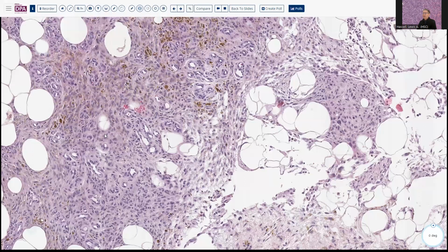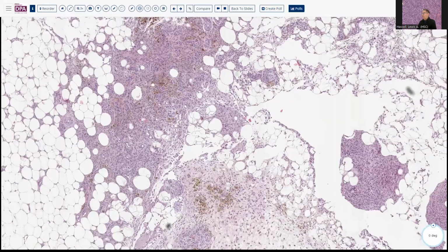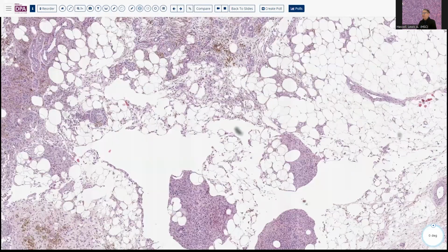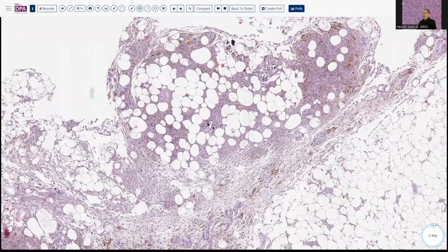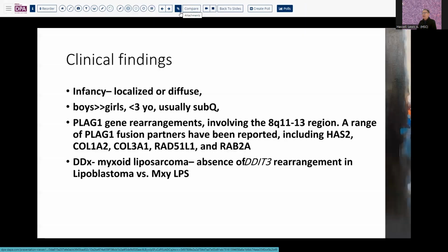We have some vasculature here, and it sort of intersperses itself around some of the fat. So you could see how it might be easily confused with sort of fatty invasive or infiltrative neoplasms like DFSP or the plexiform fibrohistiocytic tumor. So that's a rare lesion that we don't encounter very often, thankfully.